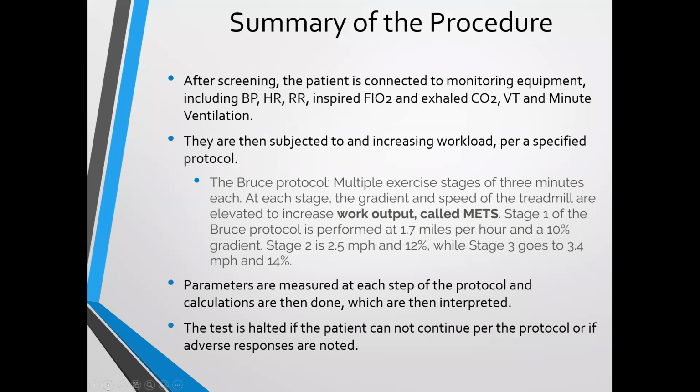Summary of the procedure. So, after screening the patient, the patient is connected to the monitoring equipment, and you can see, no surprise there. But they're also connected to either a mask or mouthpiece for the FiO2, the exhaled CO2, and the volumes. Okay. Subject to increased workload. And again, the Bruce protocol, I mentioned, is multiple stages of 3 minutes at each stage, with the gradient and the speed of the treadmill changing. Okay, this is just an example.